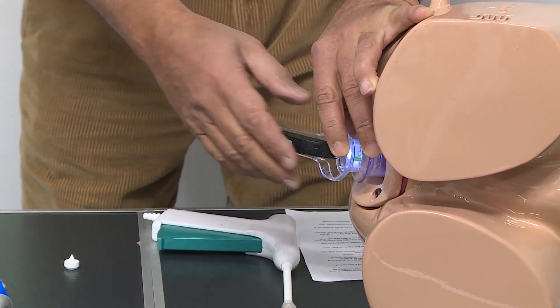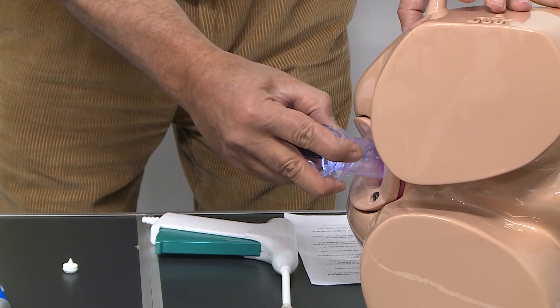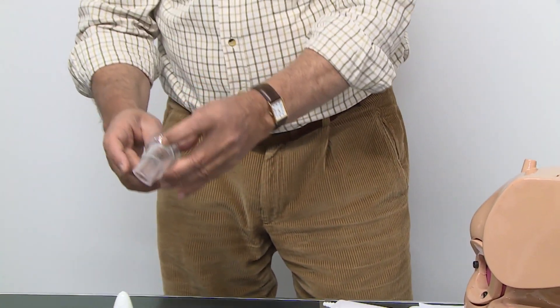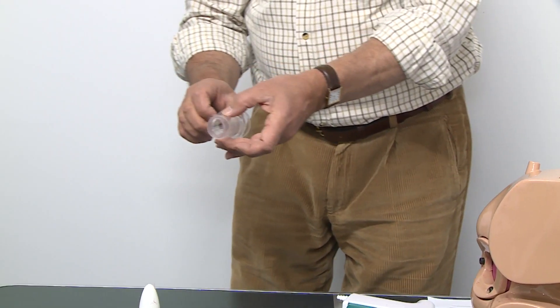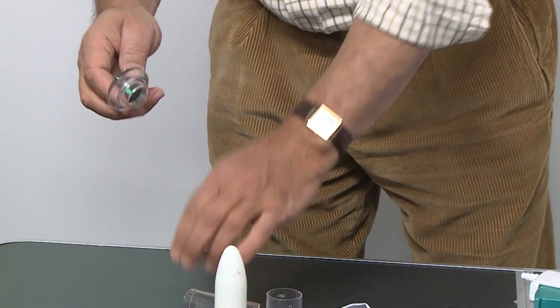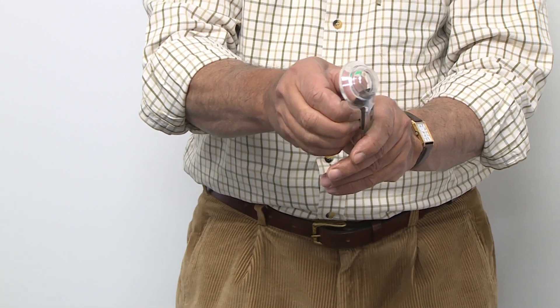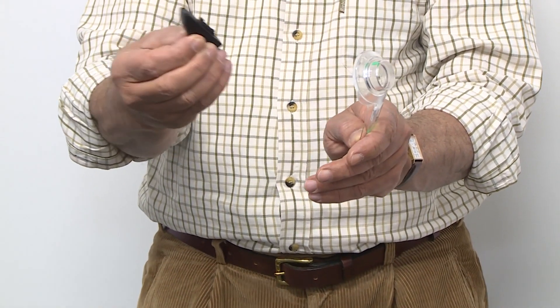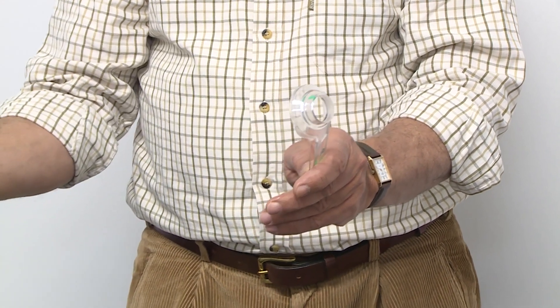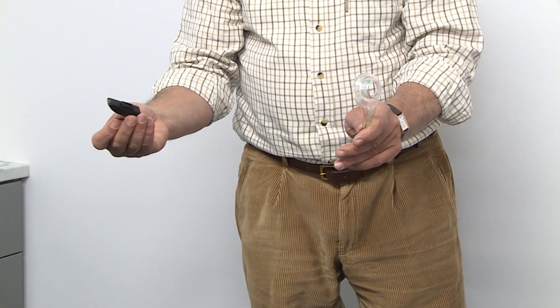At the end of the procedure, because it is lubricated very well, very slowly we can extract the whole scope out. This will be disposed of — all of it — into the clinical waste. But before we do that with the handle, it's very simple: we pull out the light module, it comes very simply out of the handle, and that would be disposed of with battery disposal according to your local policy.